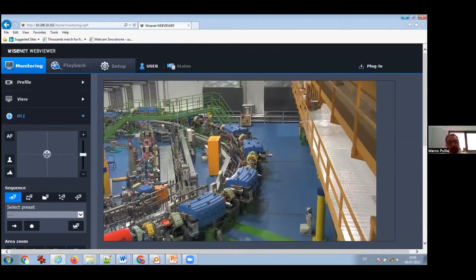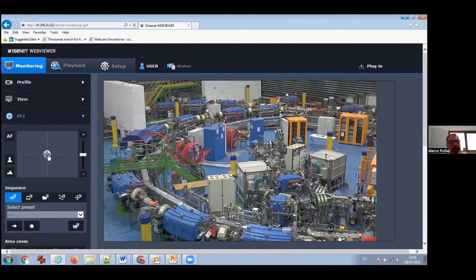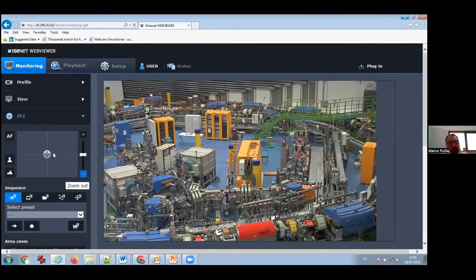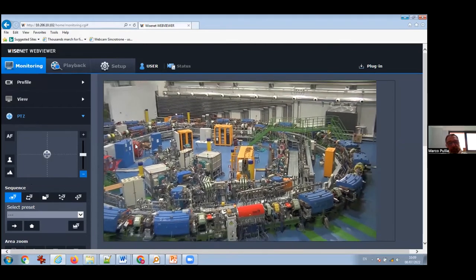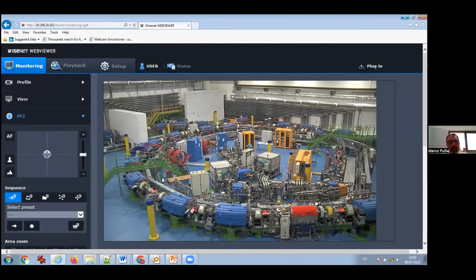It's the first step towards multi-energy extraction in our machine, which is not particularly comfortable with the Betatron core extraction. For multi-energy extraction, the RF knockout is much more suitable.